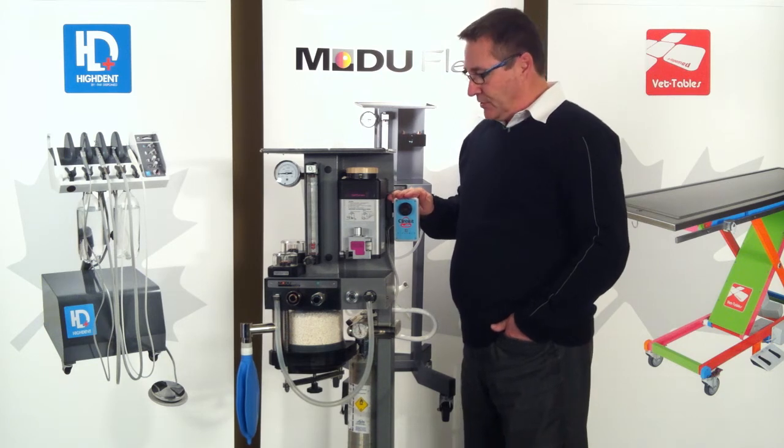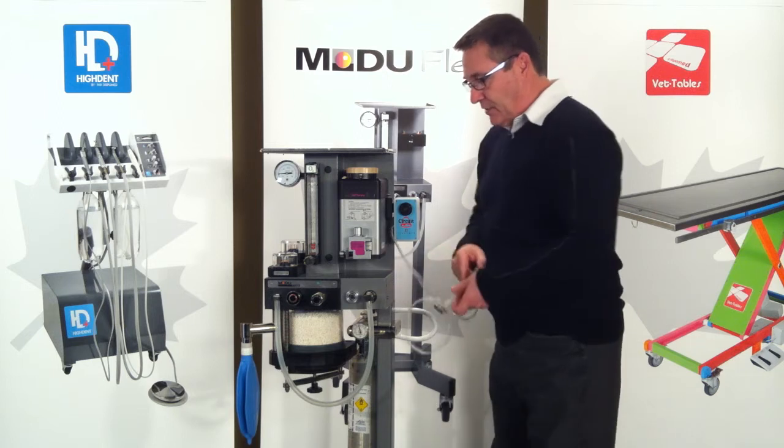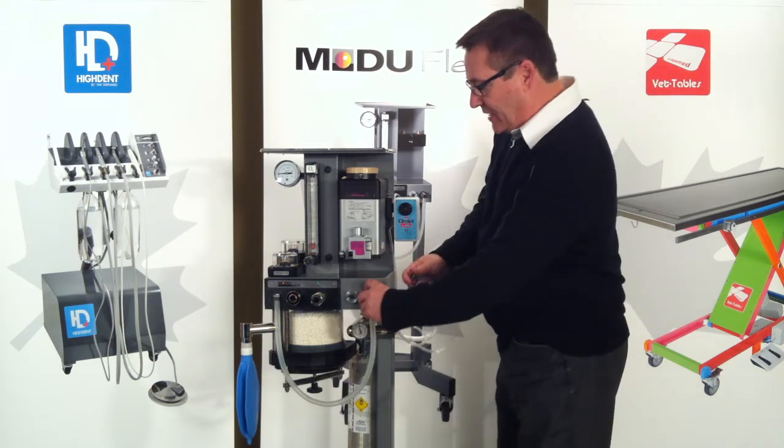They're easy to install on any type of anesthesia machine. All you have to do is hook up the line in series with your fresh gas outlet.